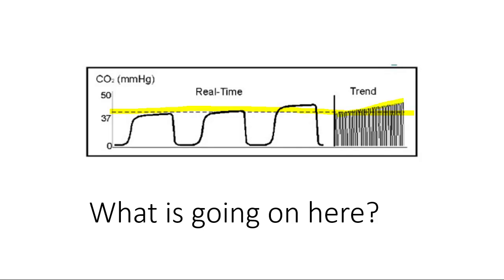This is why trends are handy when you have a graphic representation like this. You notice that your trend is rising. So what's going on here? I'm going to ask you to pause and contemplate, and then tell me what you think it is.